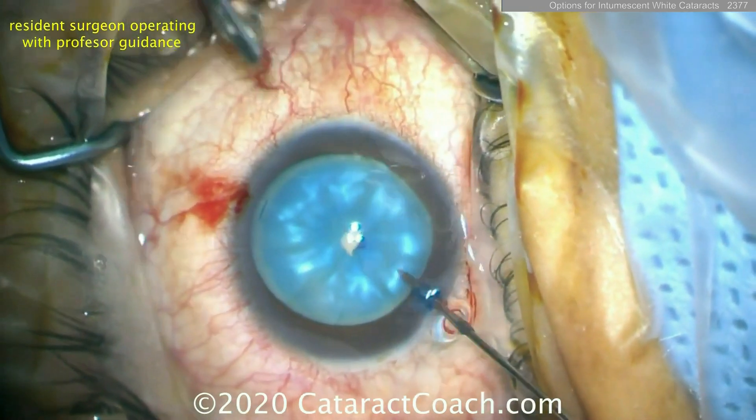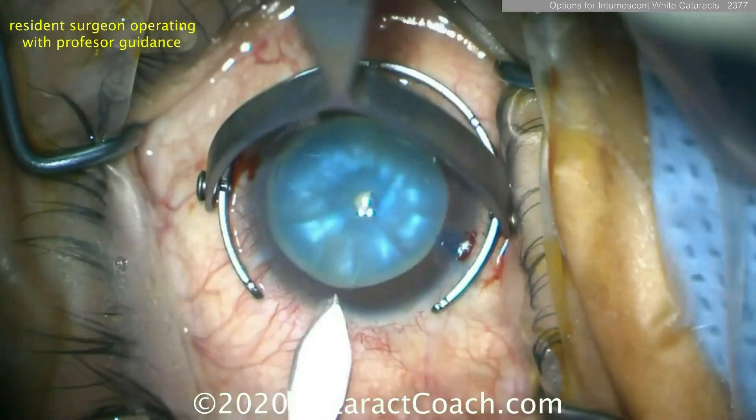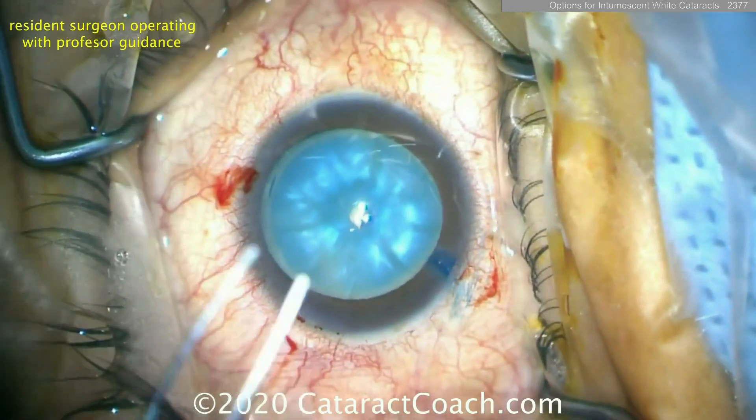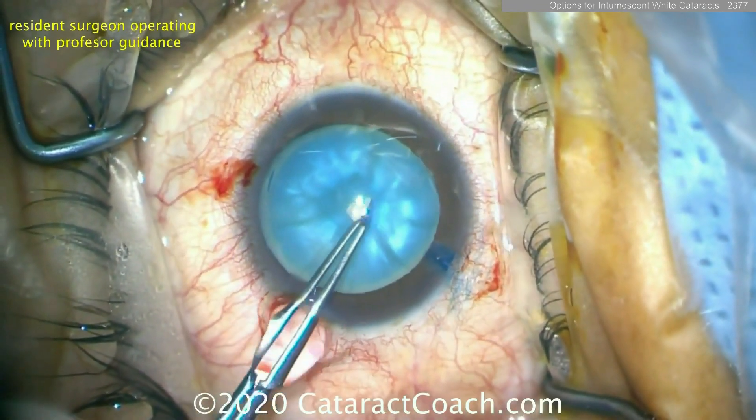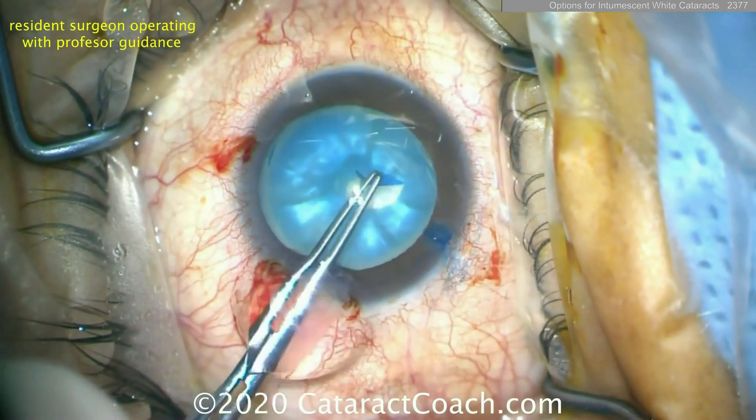Let's show you another case. Here's another one — needle decompression often does work. Go inside with a needle, aspirate, and remove a lot of the trapped liquefied lens cortex. Now get the rhexis done. You can also do a double rhexis technique, which means do one small rhexis first, then enlarge it.